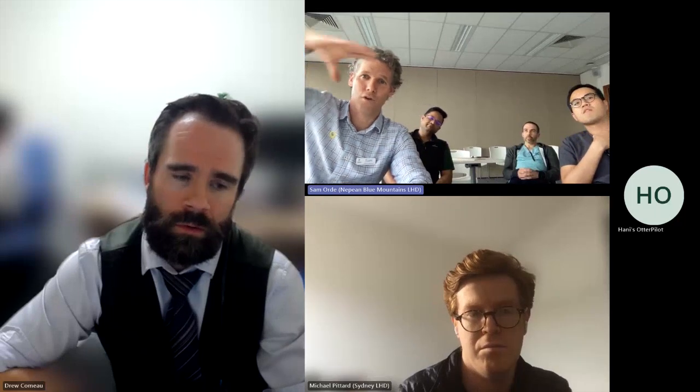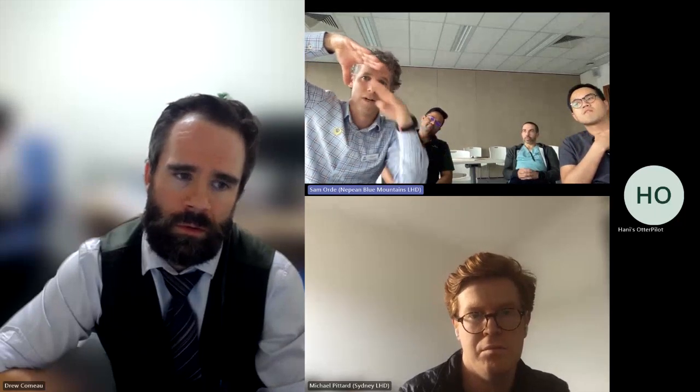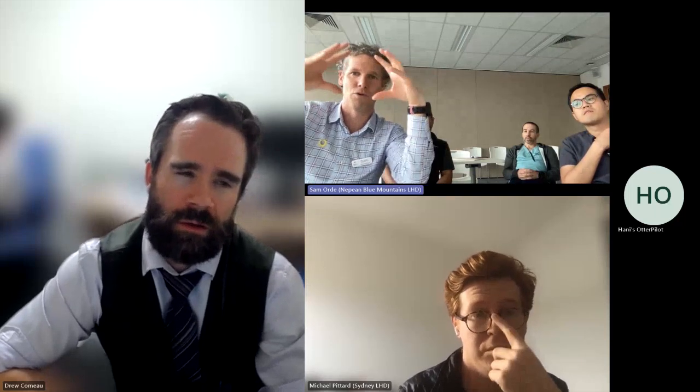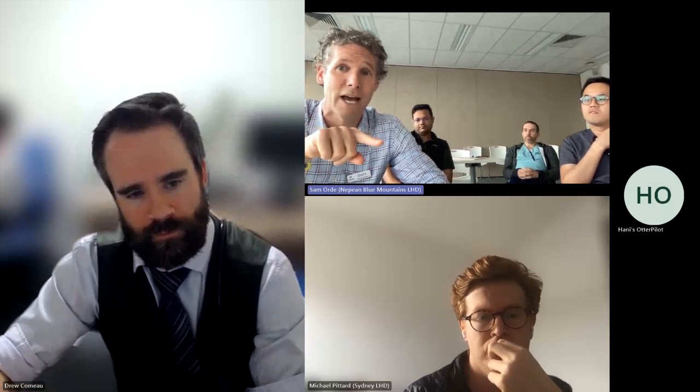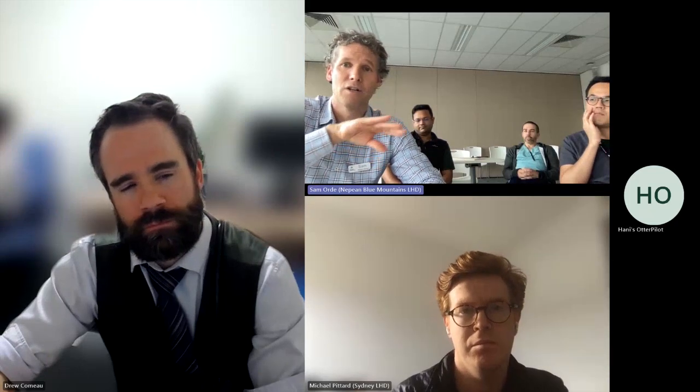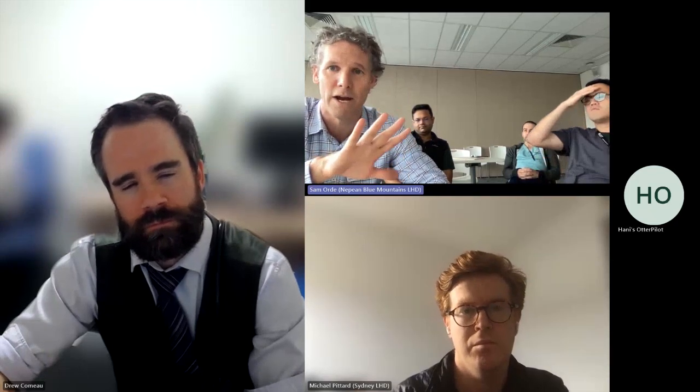So if you've got the apex of the heart, it's got more acute angles at the edge, as opposed to an acute thrombus. It's got more of a lumpy appearance, like that one in the right atrium of the last patient. So for my classic things, if I look at that thrombus in that right atrial case of that lady with the HITS, that's an acute thrombus: homogeneous, independent motion, bouncing around a little bit, smooth-walled, light gray.